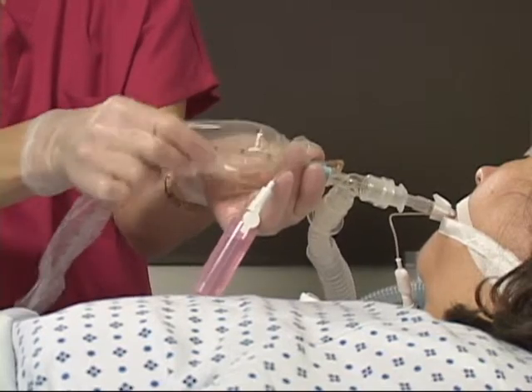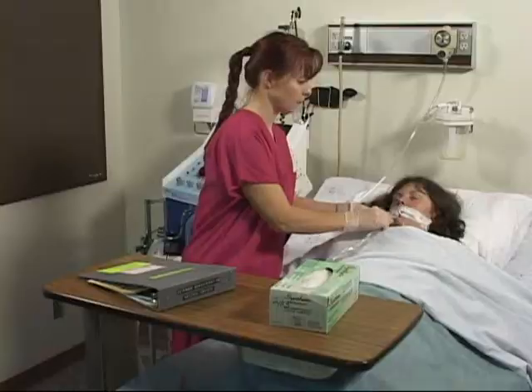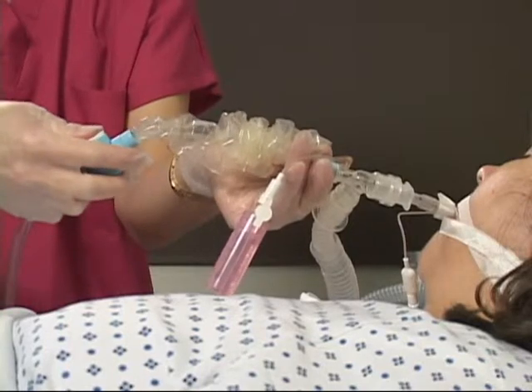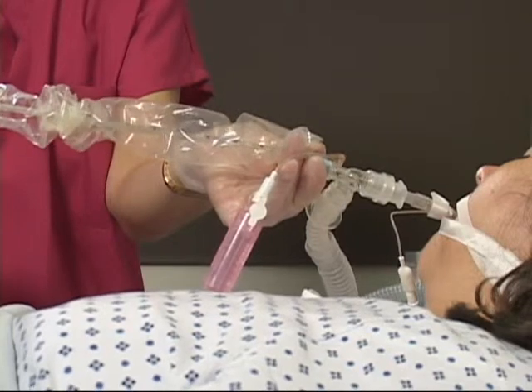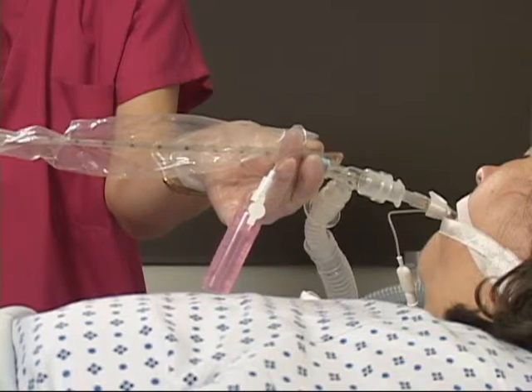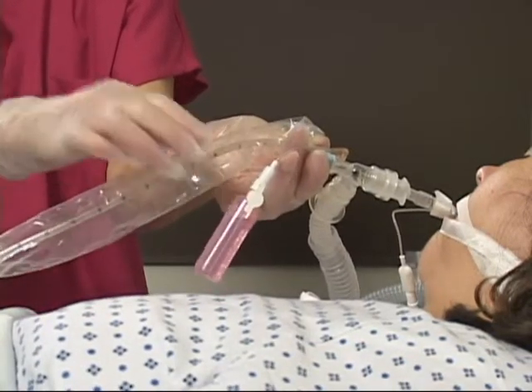Quickly but gently insert the inline catheter into the artificial airway without application of suction. Withdraw the catheter 1 to 2 centimeters to avoid suctioning tissue and apply intermittent suction while removing the catheter. This aspiration should not exceed 10 seconds but should be slow enough to allow for mucus to be grabbed by the suction tip. Before suctioning again, pre-oxygenate the client as before prior to another suction pass. To promote clearing of the secretions, ask the client to cough in between suctioning passes, if possible.